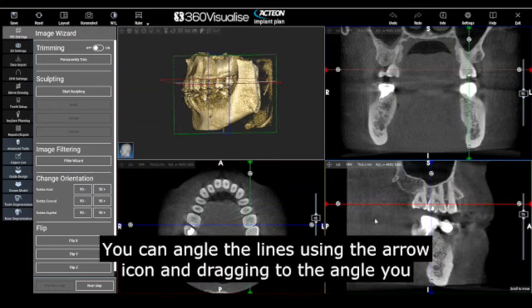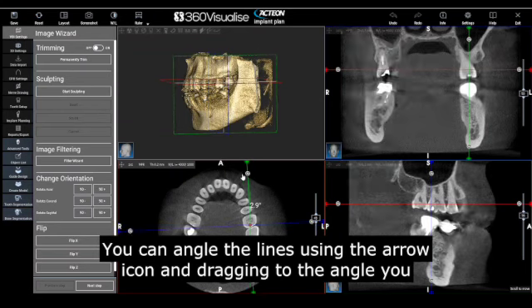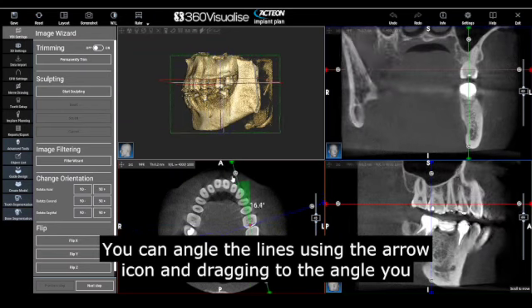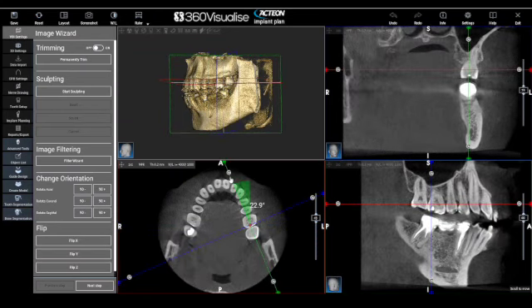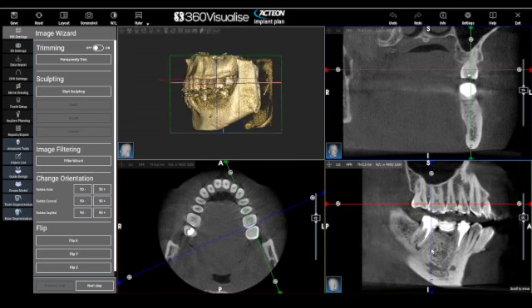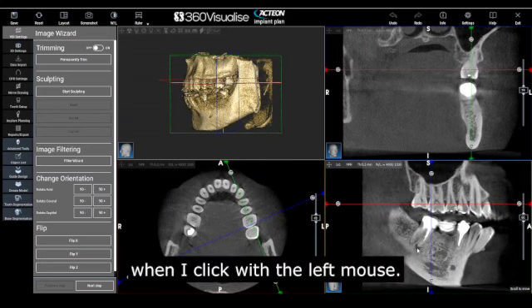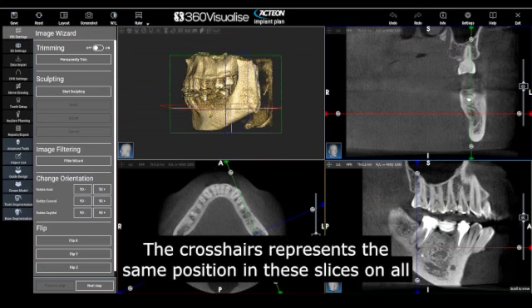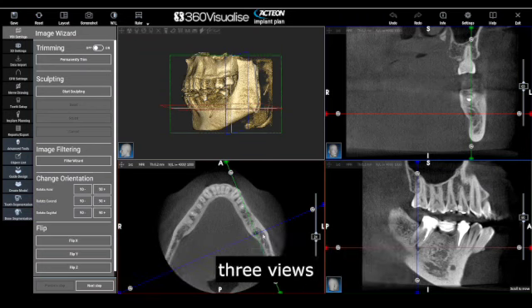You can angle the lines using the arrow icon and dragging to the angle you need. When I click with the left mouse, the crosshairs represent the same position in these slices on all three views.